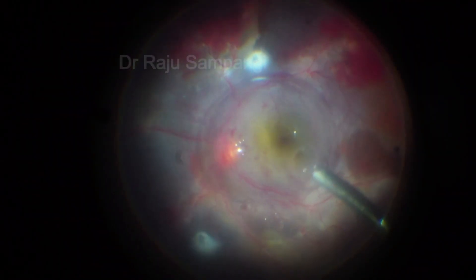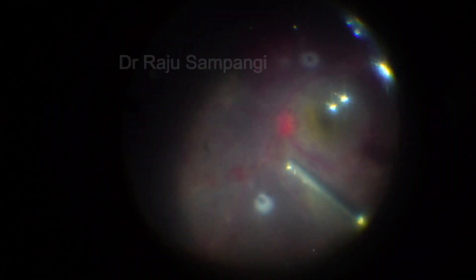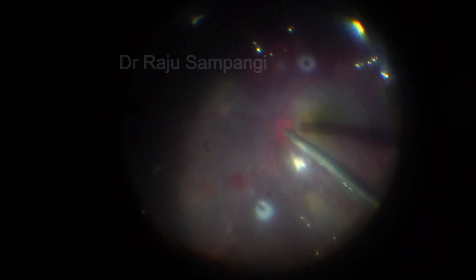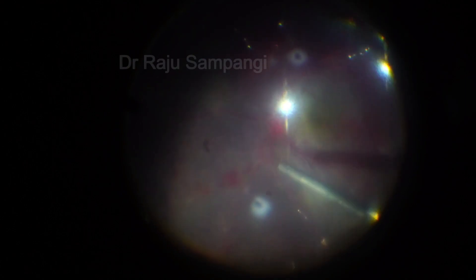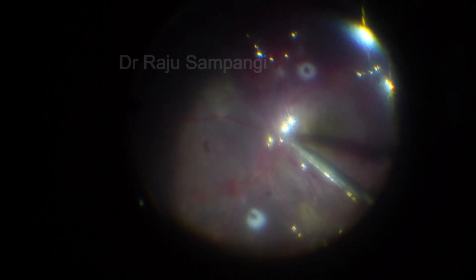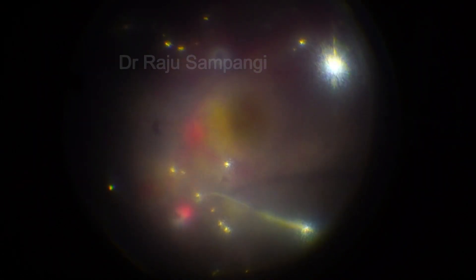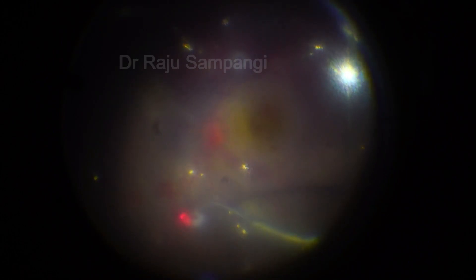A PFCL bubble was used to displace the blood from the macular area. Superior and inferior retinotomies were made. Fluid-air exchange was done to drain the subretinal fluid and the hemorrhage, and the retina was flattened. Endo laser was done and silicone oil was injected.